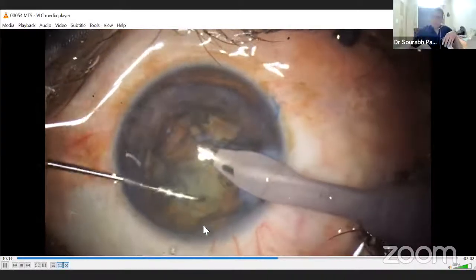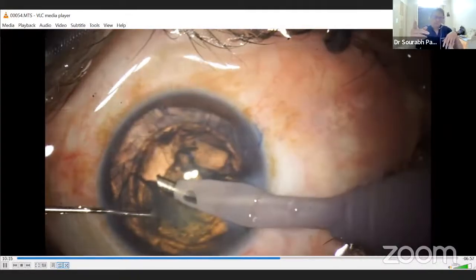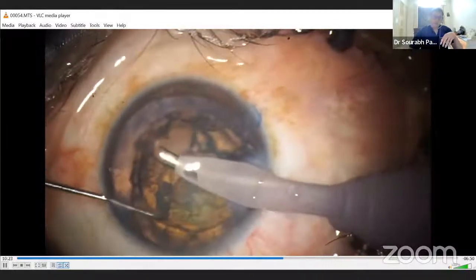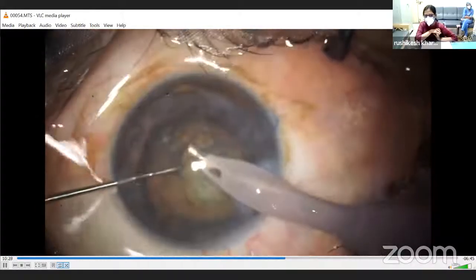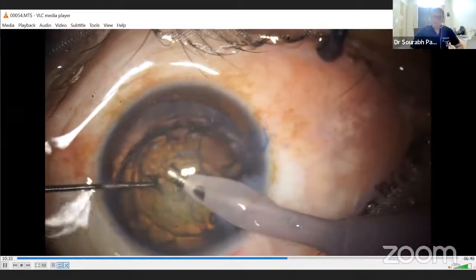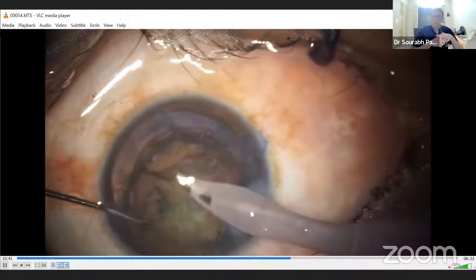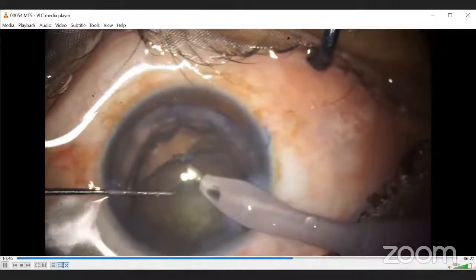So once you cut off, like here now you have cut off part of the nucleus, you can rotate it. Rather than trying to remove it from this side, you can just rotate the nucleus to the other side like this, and then you can start aspirating, because this is a little bit awkward sometimes because a large part is in the sub-incisional area. I think in this angle is more, so she's finding it difficult to rotate.